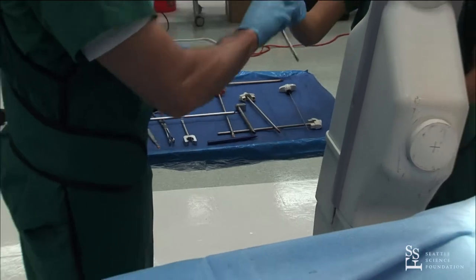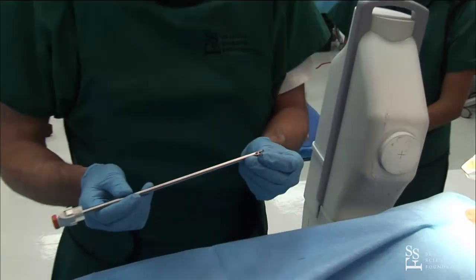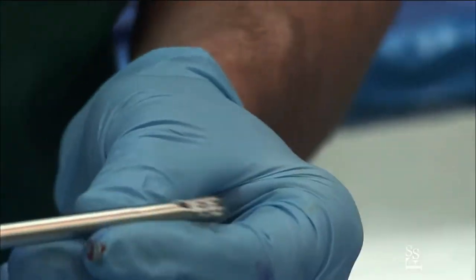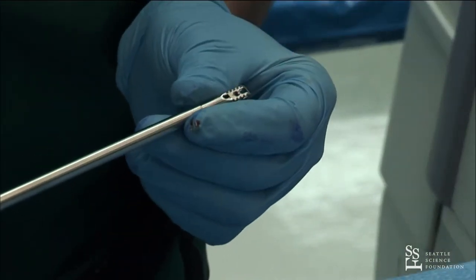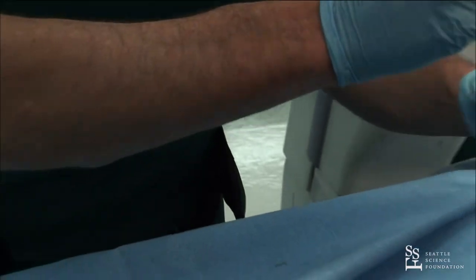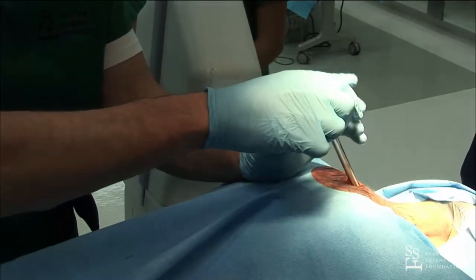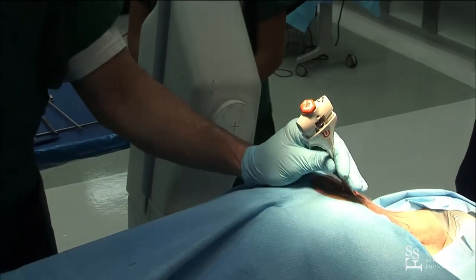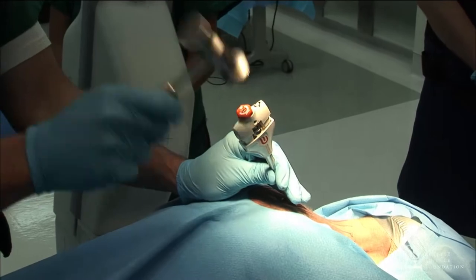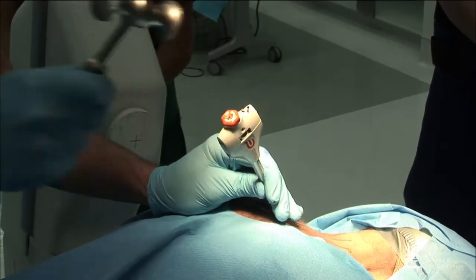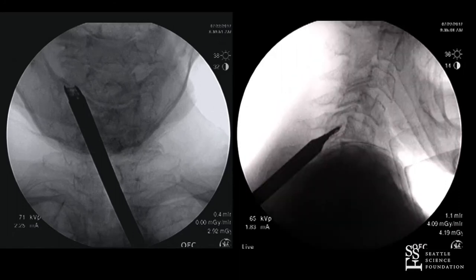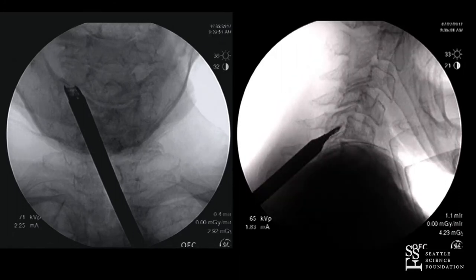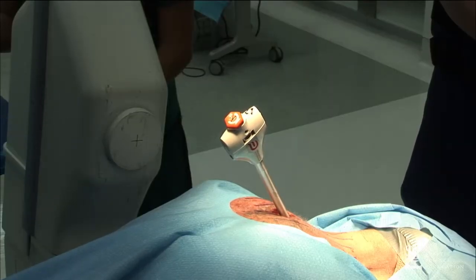The implant is a titanium cage — it's acid etched. It comes with supplemental screw fixation. It's directional and has an arrow pointing up to the head, which is fairly straightforward. So this is inserted into the joint. The important point when you're putting this in: you want to make sure that you're not backing out, so you hold firmly with one hand. Because once it goes in, it's pretty solid. It could go in maybe a little more, but that's pretty solid. You can pull a cadaver up — it probably has over 50 pounds of pull-out resistance. It's very, very stuck.